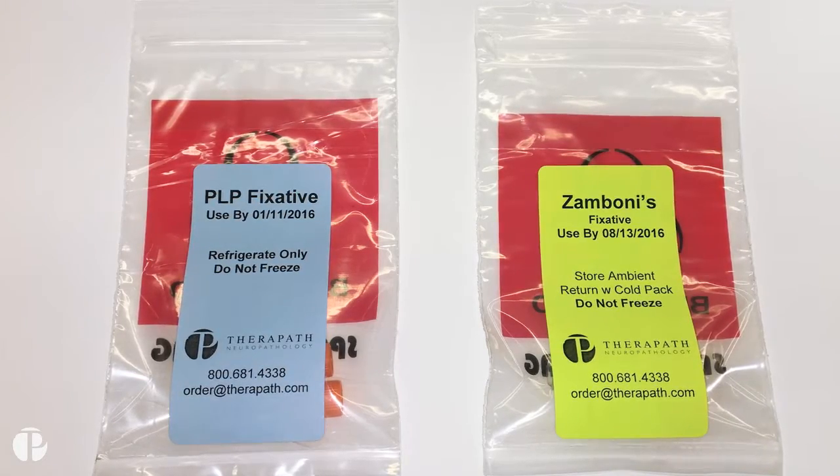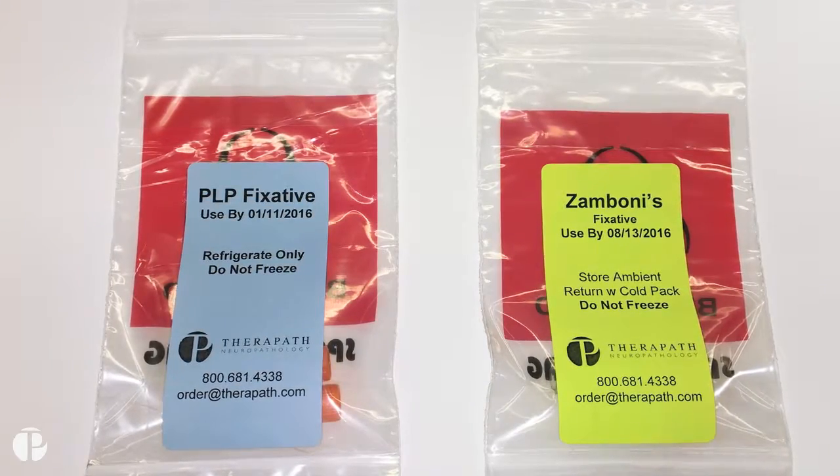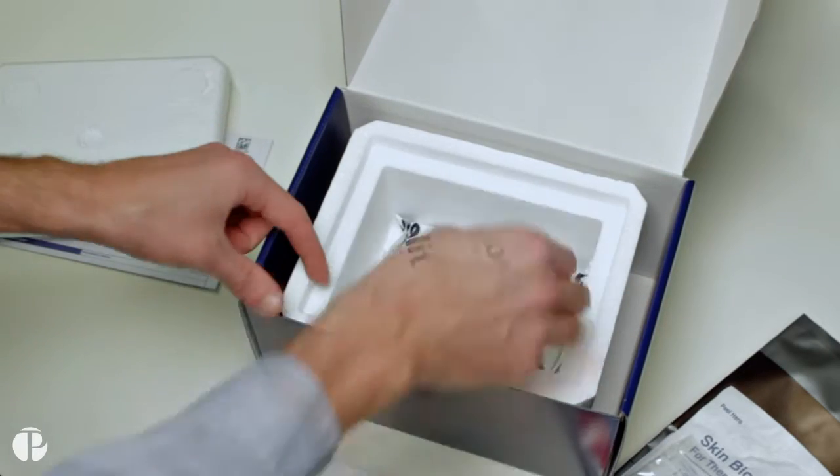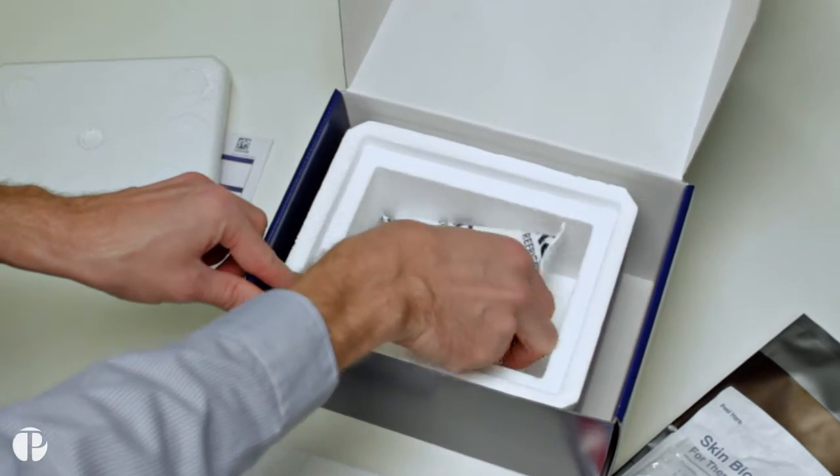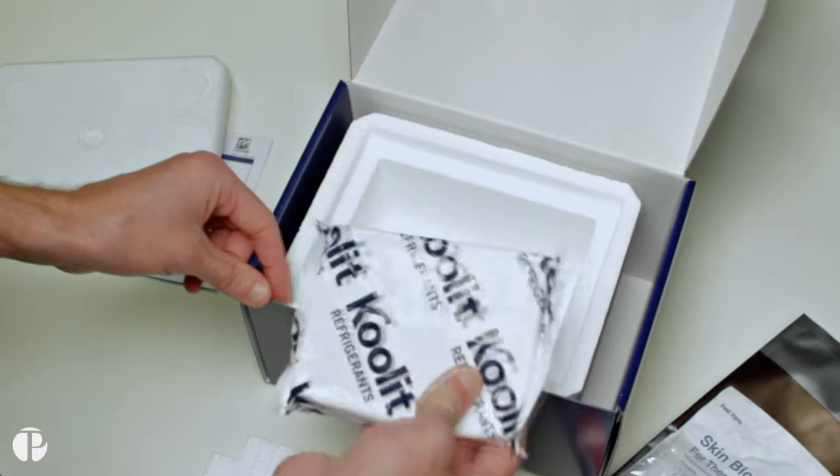Zamboni's fixative is good for up to one year and can be stored at room temperature. At the bottom of the cooler is an ice pack that needs to be frozen for the return shipment. The other components should be stored at room temperature until needed.